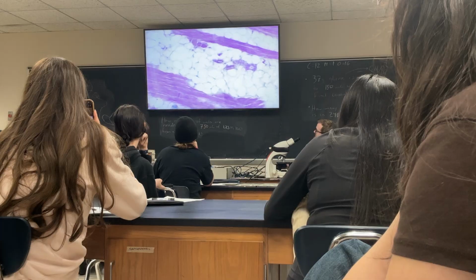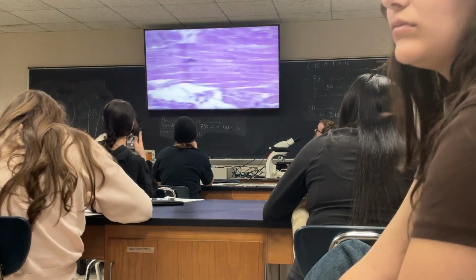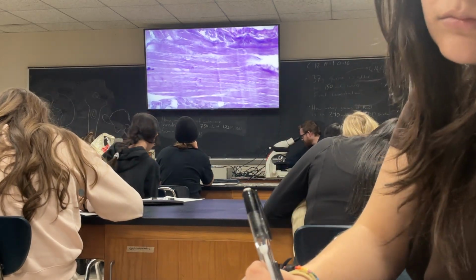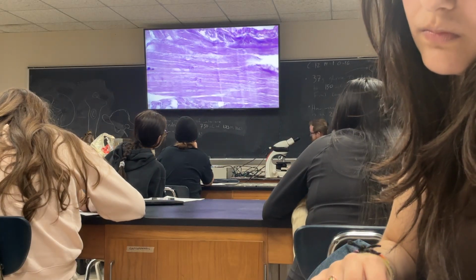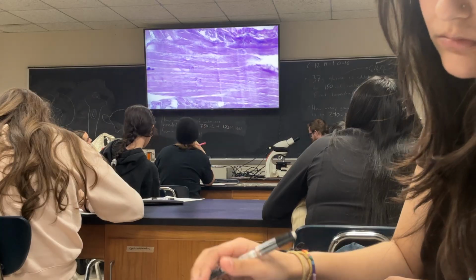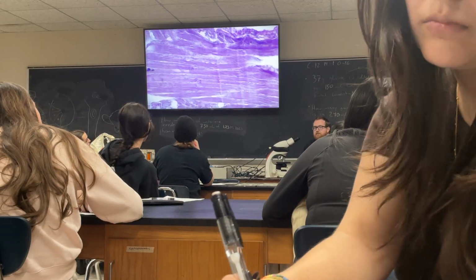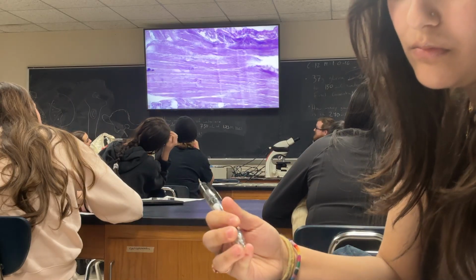What type of tissue is this? Yeah, adipose. This is kind of a rough view for you guys, so I'll try to find some other examples. But what tissue do you think this is? Does it look stronger to you?